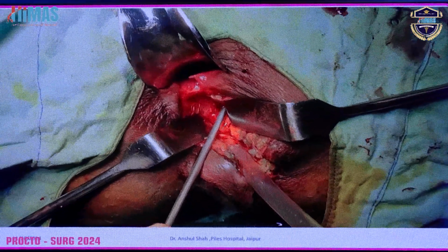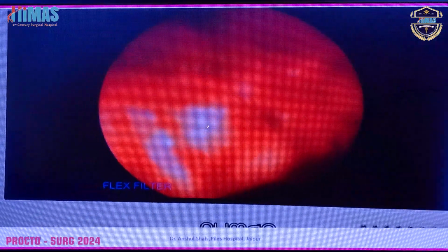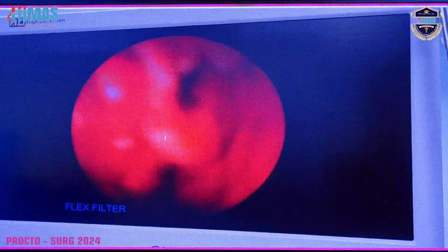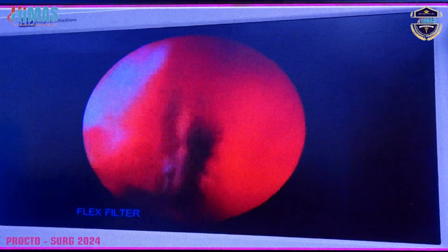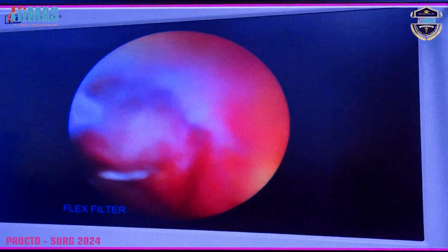After checking it, even this scope helps you to wash, because it has a good pressure inside. So the pressure goes inside, and also we wash it. And definitely we can also do it with the help of a syringe, that is not much of a deal. So this is how the image appears inside. And you can see this is the granulation. If we see some granulation, we can remove it either by using this brush, by using the forceps, or even by a simple curettage.